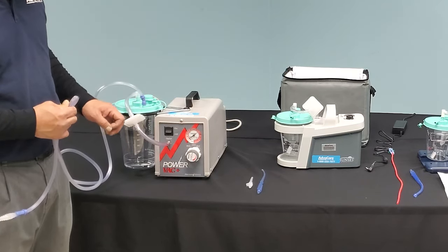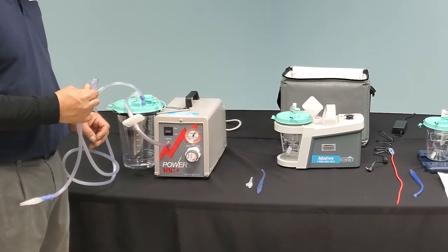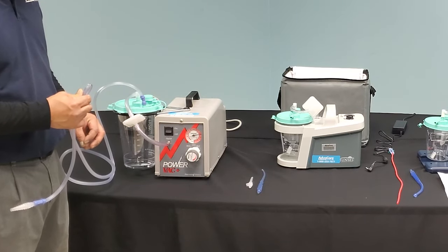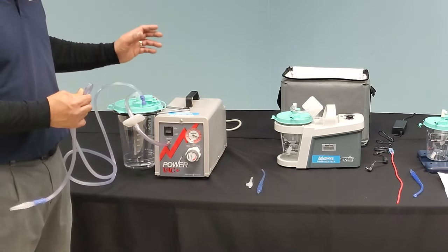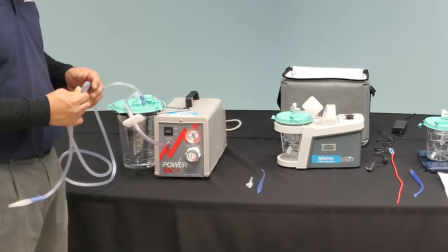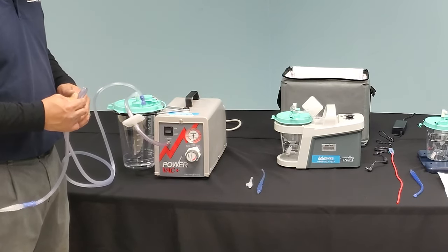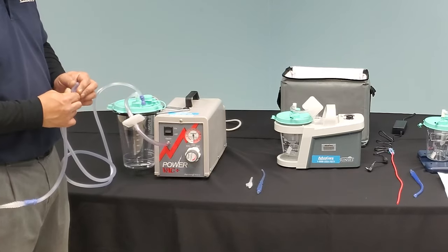It will then pressurize once again and continue in the same cycle fashion to slowly move the fluid as it is being created and produced as the body metabolizes the nutrients and food the patient has consumed.